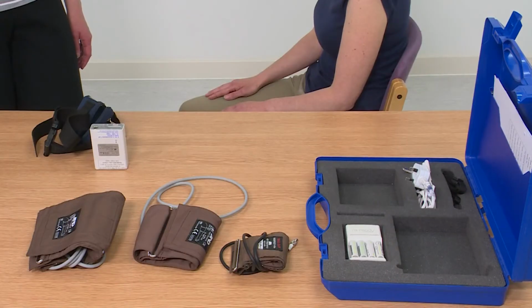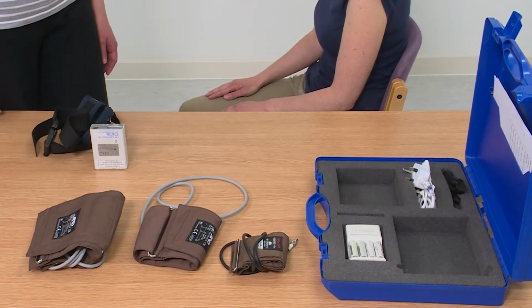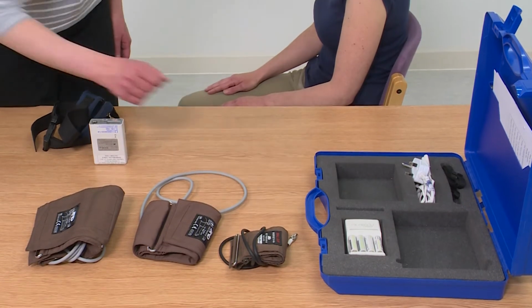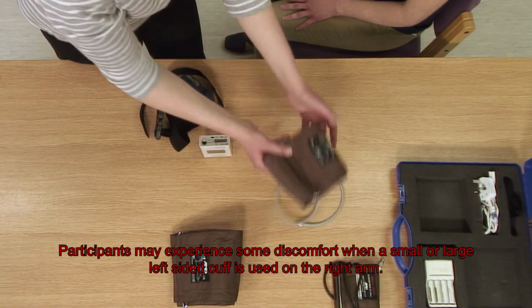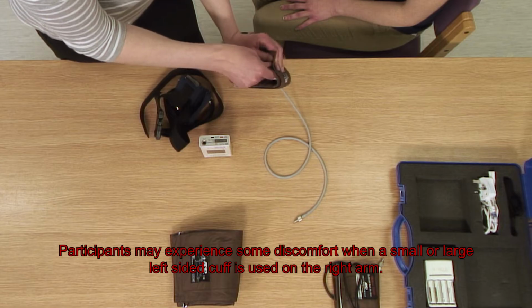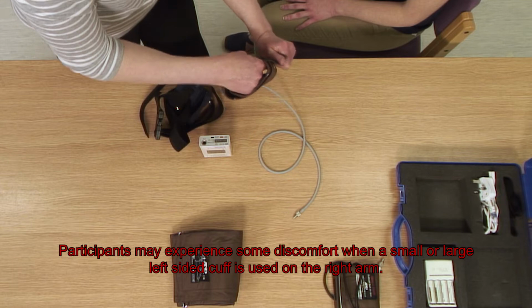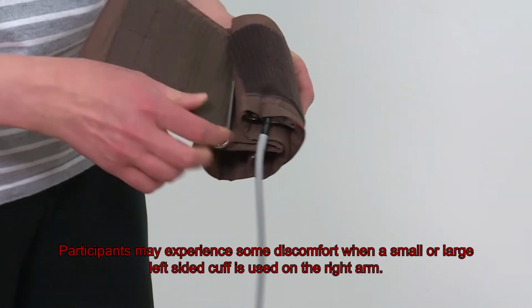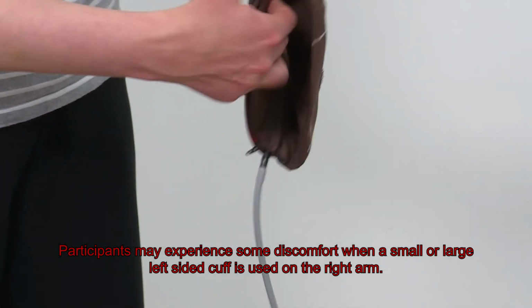For the left arm, adult or large adult cuffs are supplied. A small adult cuff can be requested from the Oxford team if needed. For the right arm, only an adult cuff is purpose-made. For the other sizes, please use a left-sided cuff, taking care over positioning. The cable should go upwards towards the shoulder.